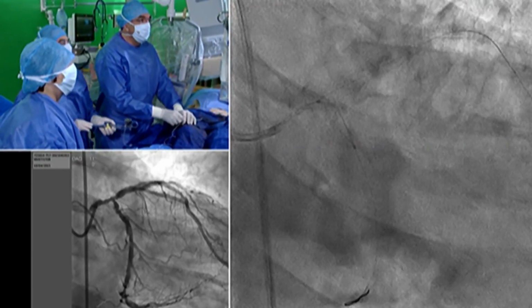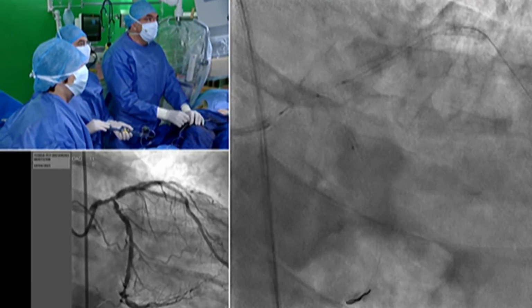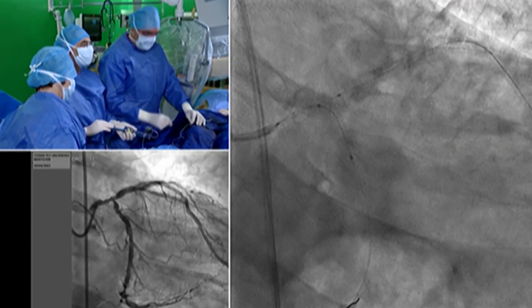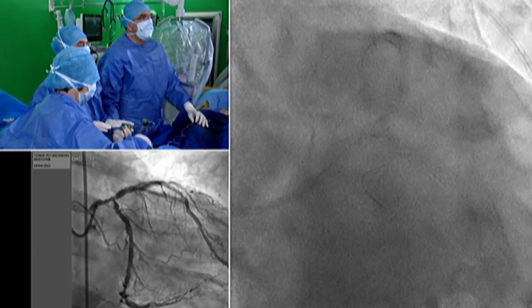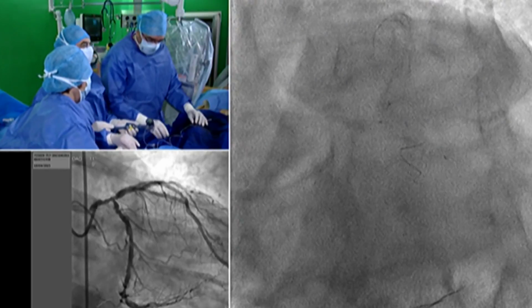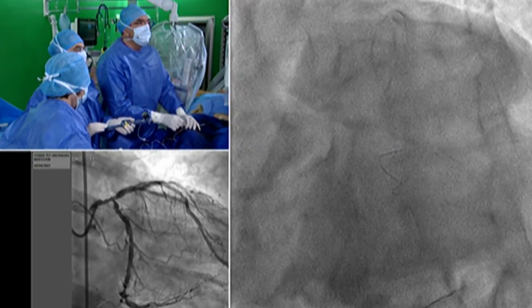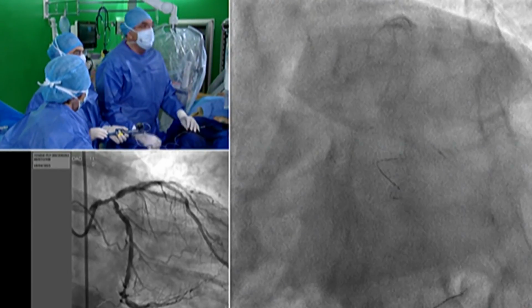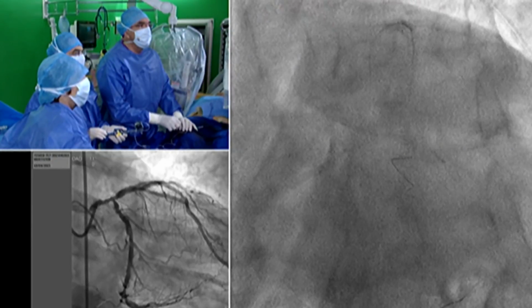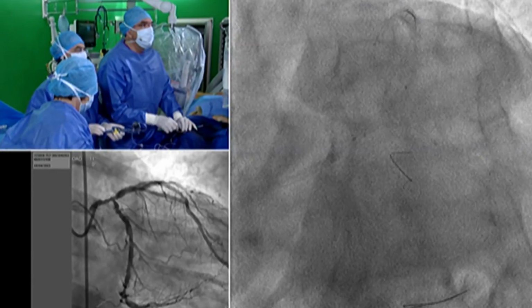Maybe the wire is a little bit twisted sometimes, and particularly with the big balloons, we have some difficulties, but this is okay here. We can check in the caudal view, but I think it's okay. We could remove a little bit of the 3.5 and advance a little bit in the 4.0, because it's quite distal.